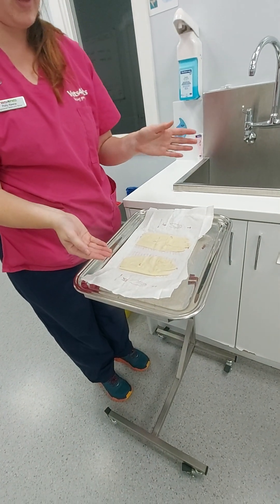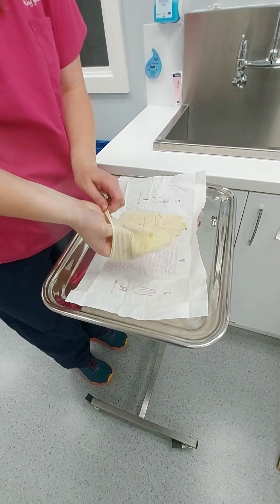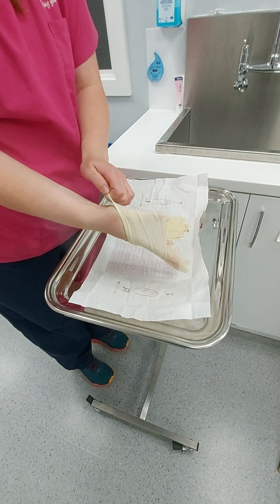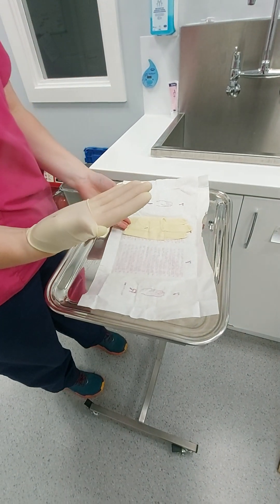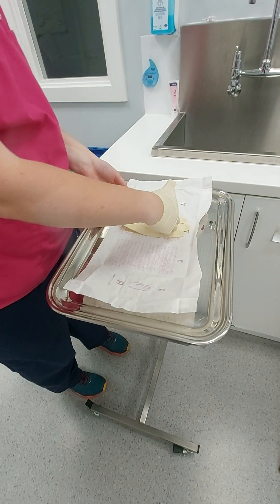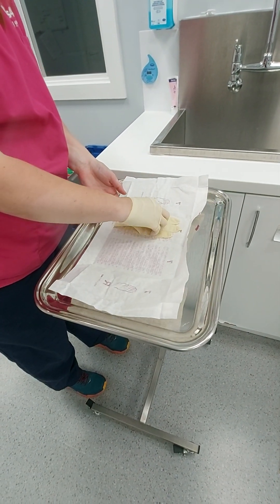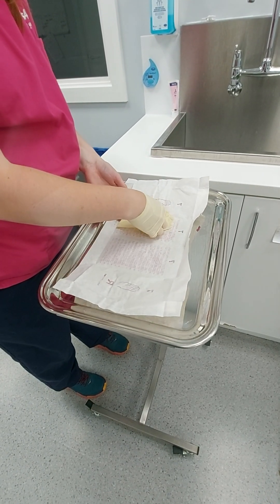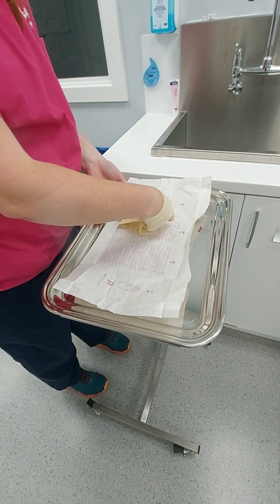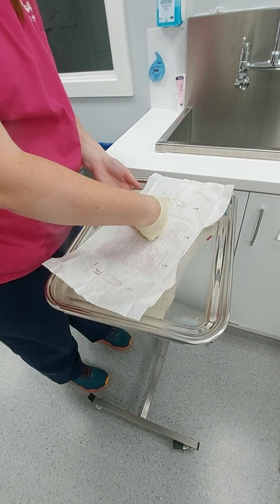I'm right-handed, so I'm going to go for the right hand first. I'm going to put my hands in. Put them in there, and then using your other hand you can shimmy underneath here. These are incredibly stuck down, so I might have to do a little cheat here — I'm trying not to do this, but it's not ideal, but you sometimes have to do it. But this hand is sterile, so it's okay to give it a little bit of a wiggle just to get the end in.